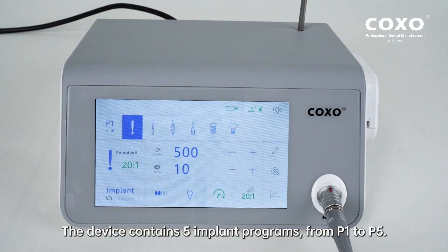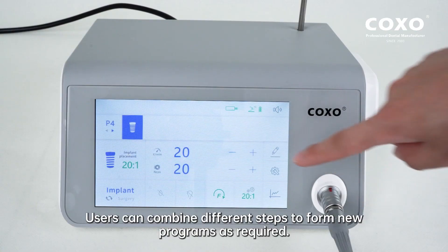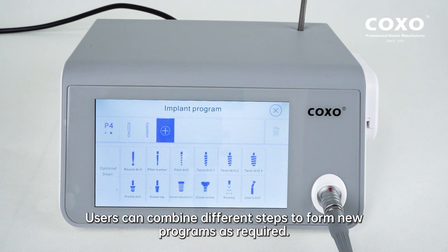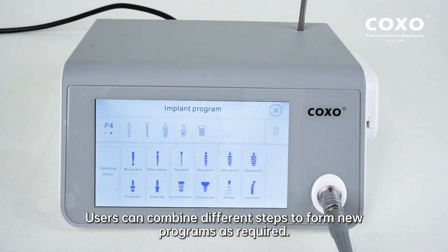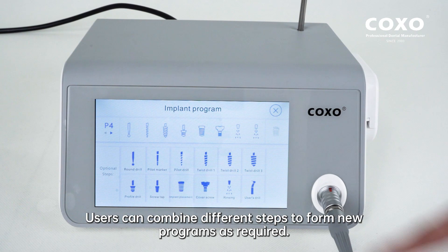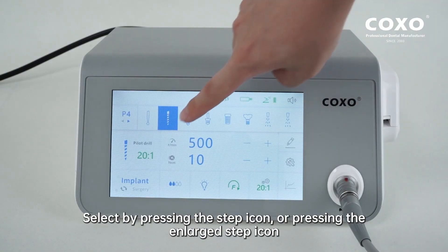Implant Mode: the device contains five implant programs, from P1 to P5. Users can combine different steps to form new programs as required. Yes means to save, null means not save, and cancel means returning to the modification screen. Select by pressing the step icon or pressing the enlarged step icon.